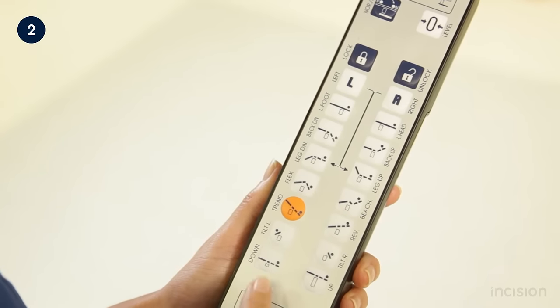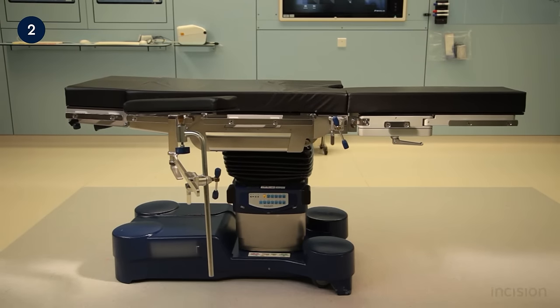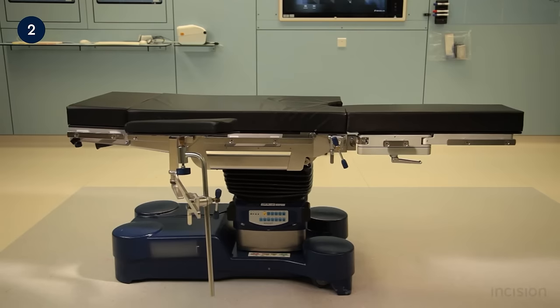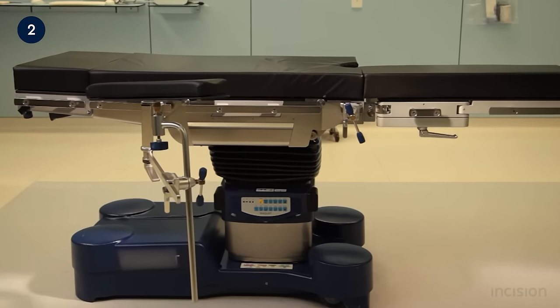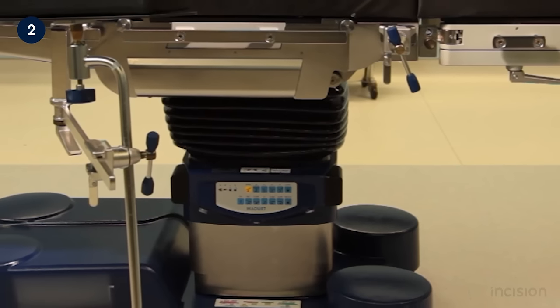The remote control can also be used to adjust the height of the table. This allows the surgical team to work in a manner that is as ergonomic as possible. It is important to note that the table has a maximum weight limit of 450 kilograms. The table's control panel is housed in the table column and has the same function as the remote control.